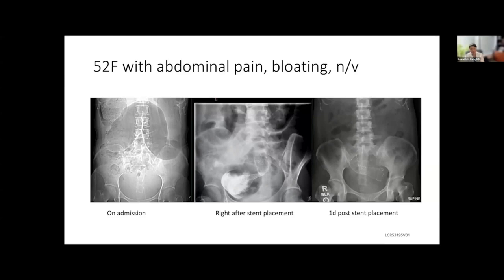So that's pretty much it. Again, the reason why I went over the stent designs and differences and the companies that make the stents is not only for marketing reasons, not only royalty reasons, or because you're loyal to one brand or another, but because there are actual design differences. Despite all the stents being made out of nitinol, there are definitely innate stent design differences that, as hopefully you've seen today, make a clear difference, especially in the colon and duodenum, especially in the tight spaces around the bends. So I hope that was helpful.